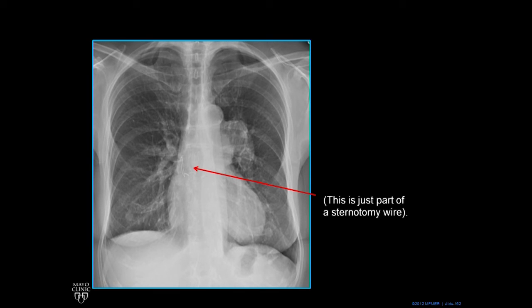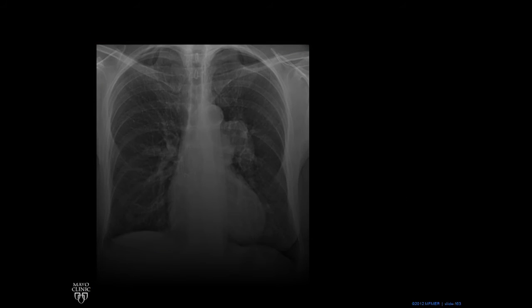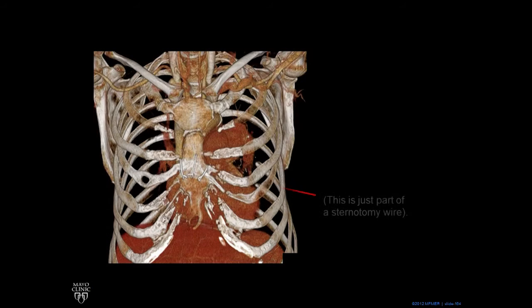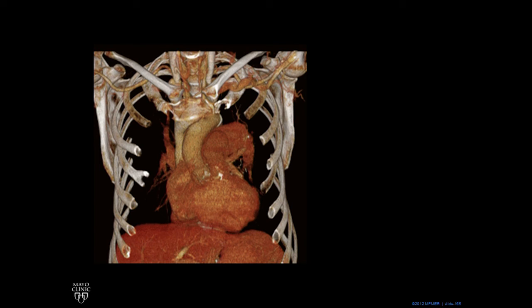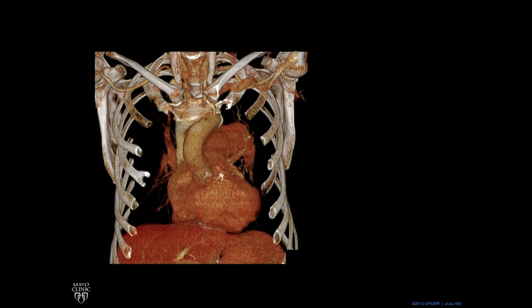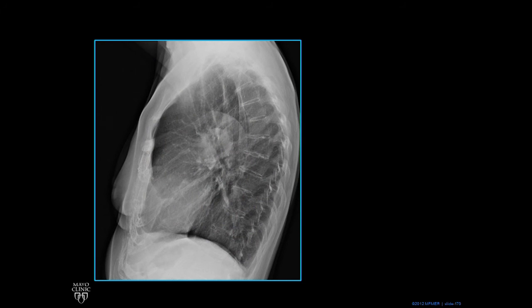That little clip is just part of a sternotomy wire — a wire from her chest having been opened previously. That's just a sternotomy wire. We peel back, and here you can see this very big left pulmonary artery making that silhouette we saw in the chest X-ray. Rotating around, the big left pulmonary artery makes an arch — in this case, bigger than the aortic arch, which runs superior to it.